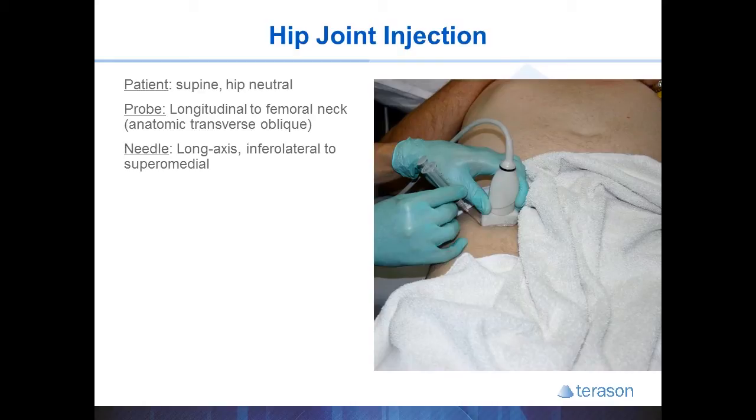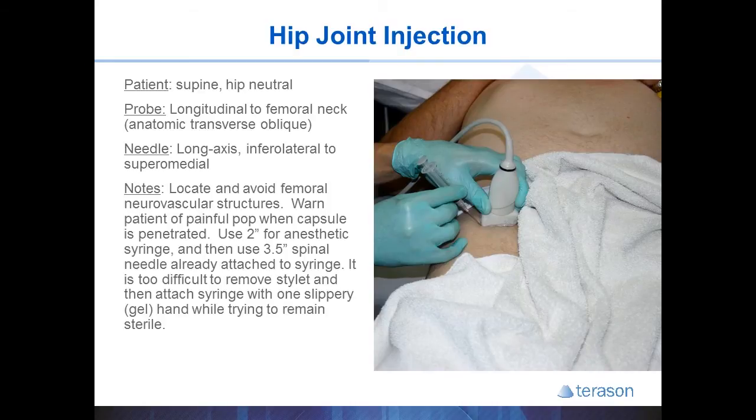You can then slide the probe along the angle of the femoral neck to see the femoral head and acetabulum appear. If you want, you can identify the neurovascular structures for peace of mind, but you will find that these are far away from the injections you are going to be doing.